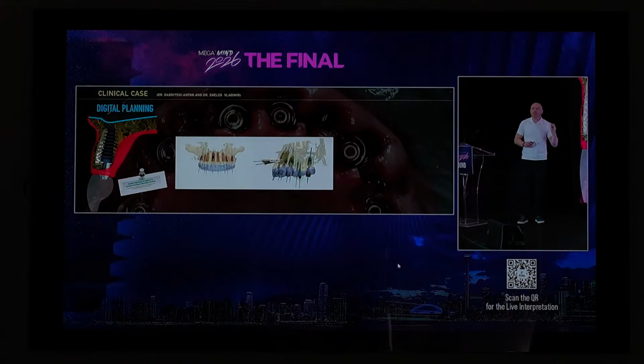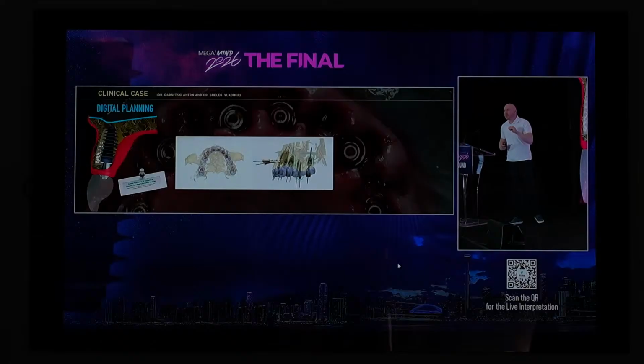We decided to place 8 implants on the jaw of this patient, because it is a very young patient and we need not only an aesthetic, functional, temporary and permanent result, but one good for everyday hygiene, and most important, a repairable permanent construction for our patient.